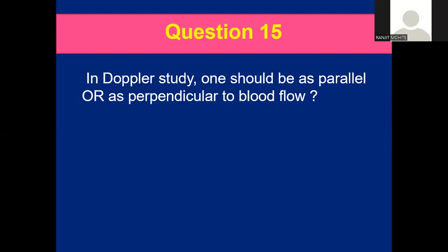In a Doppler study, should the beam be parallel or perpendicular? Parallel to the blood flow. Why not perpendicular? We will get the maximum gradient with a parallel beam, not with a perpendicular one.